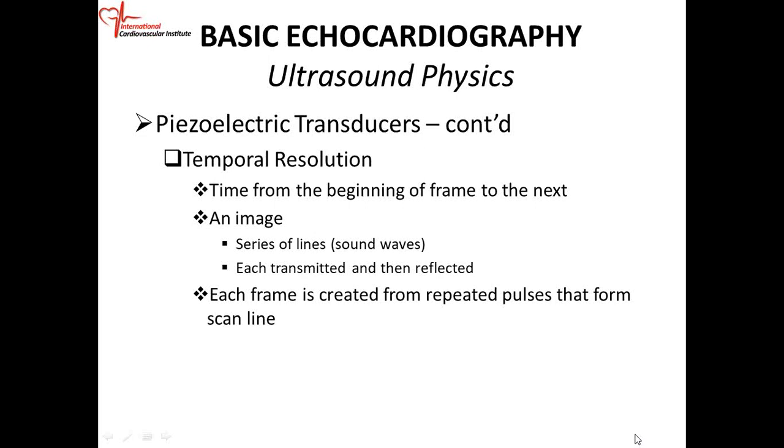Now we're looking at temporal resolution. When you do your two-dimensional echo, or you do your M mode, you'll see something we call the frame rate, and it is the rate at which you have the frames.